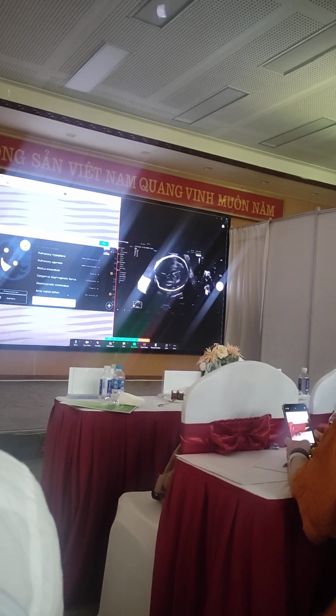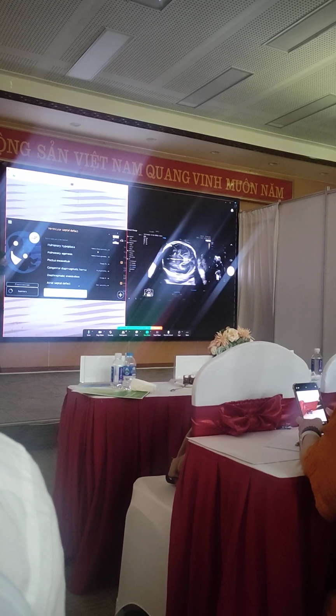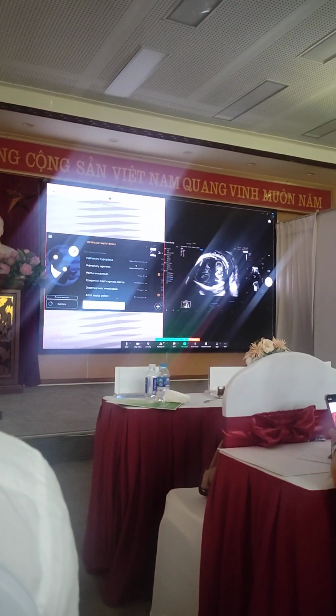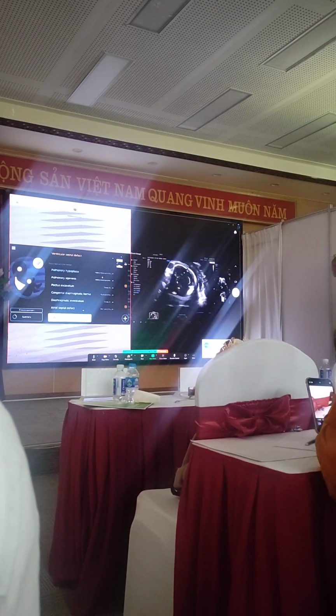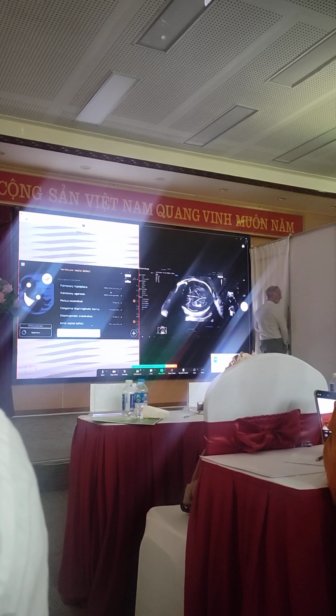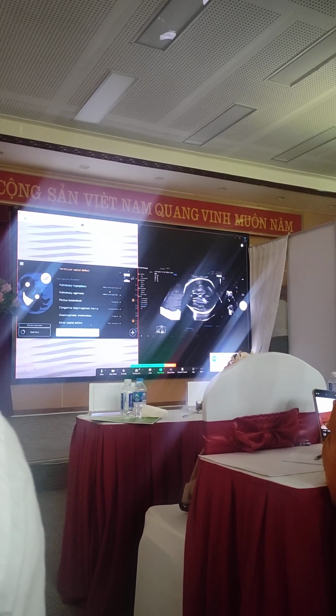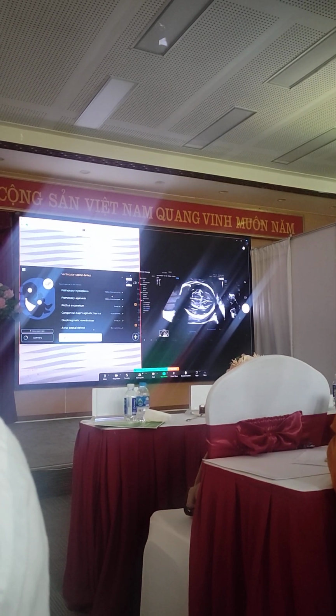At least the one we see is thin. We see the Sylvian fissure at the right place. The cerebellar hemispheres look, when you measure it obviously, but it's normal size. We can see some of the vermis anyway. And the cisterna magna doesn't look enlarged, and there is a continuous midline from front to back. And there's a third ventricle that applies.